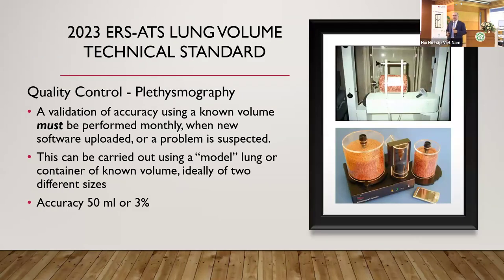The other thing, and this is new in the new technical standard, they wanted to have a mechanical verification process for the body box mechanism itself. In the previous standard, it stated that this needed to be done periodically. So what ended up happening is nobody did it ever, because they said periodically, they didn't put a time by it.